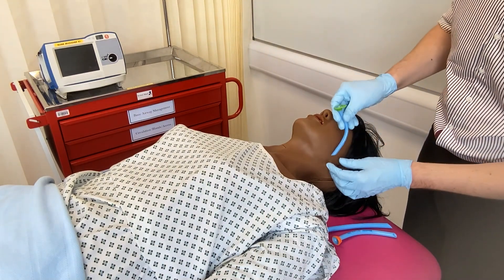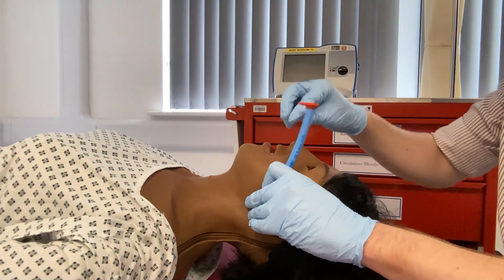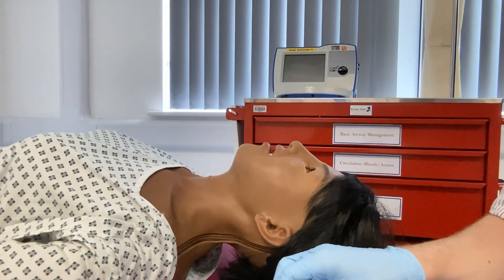The red or size 8 is too large. Equally, the orange or size 7 is too large. But the green or size 6 fits this mannequin adequately. NPA should be avoided if there are concerns about a potential base of skull fracture.